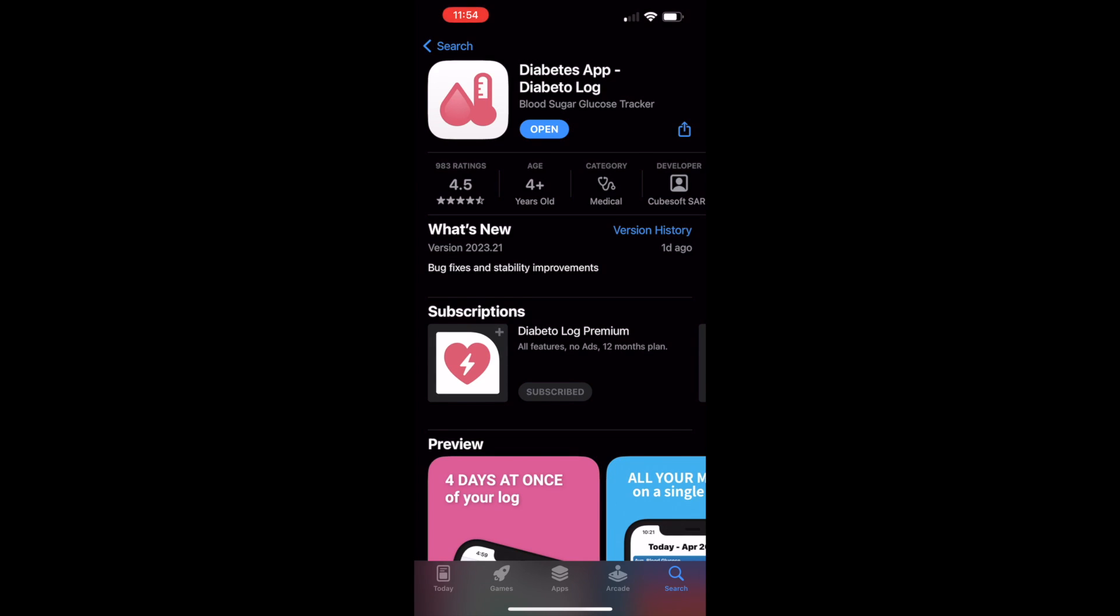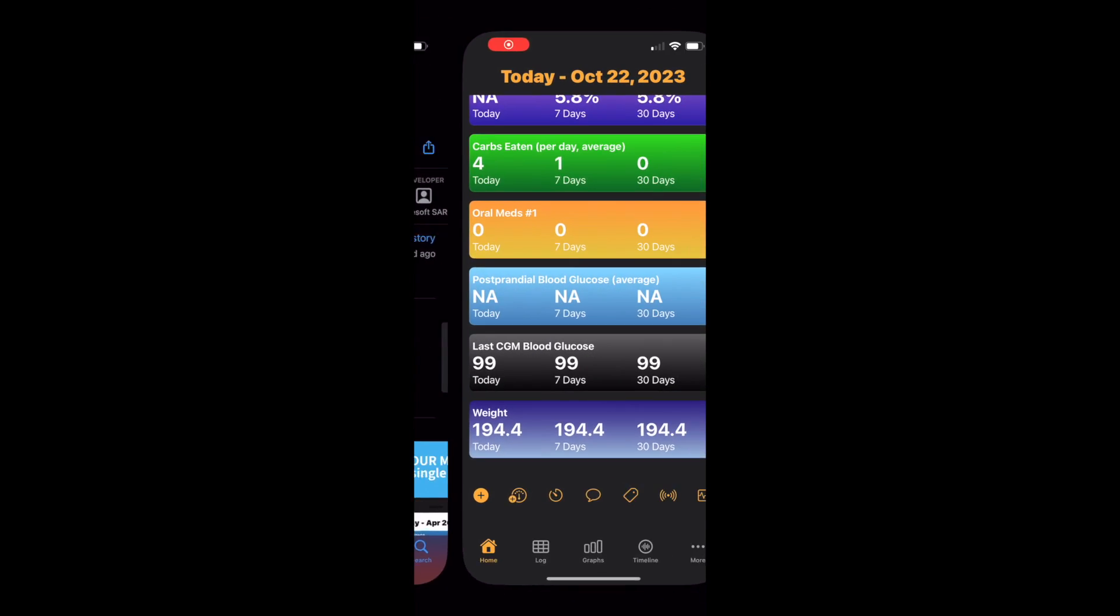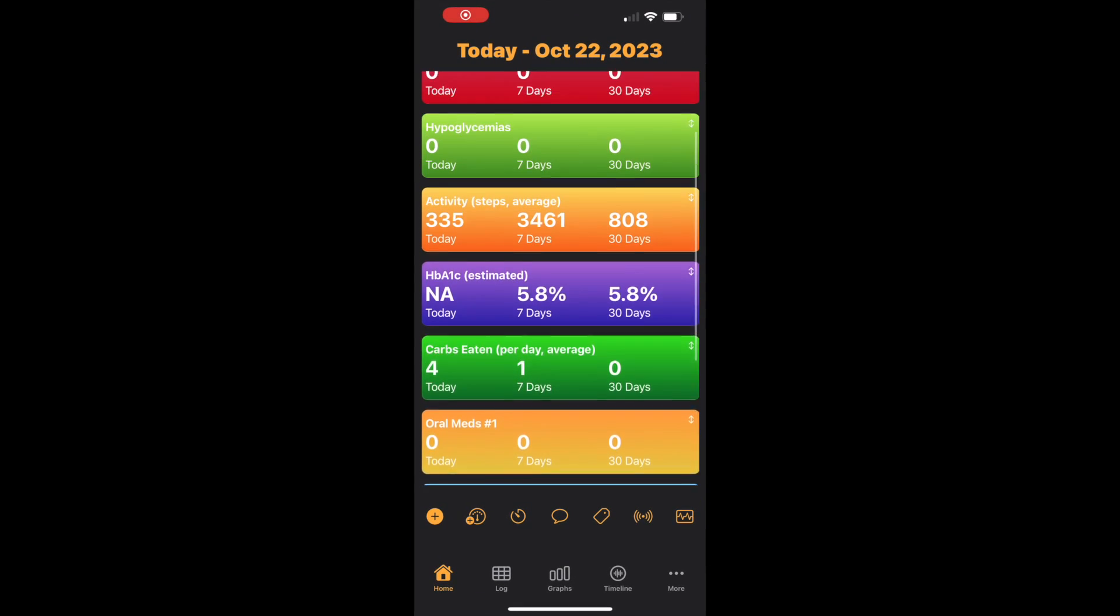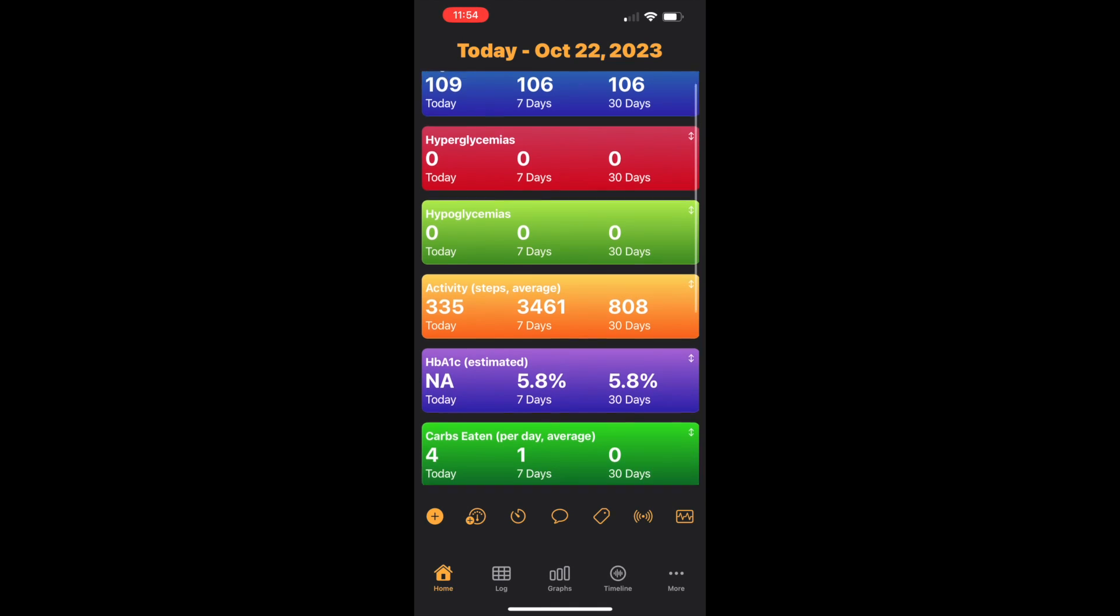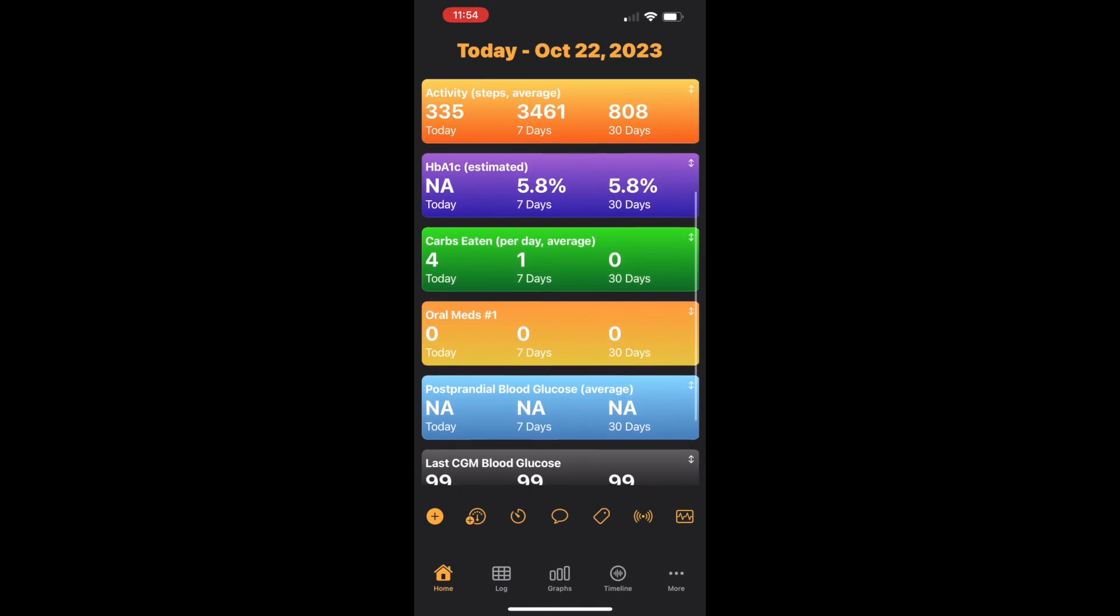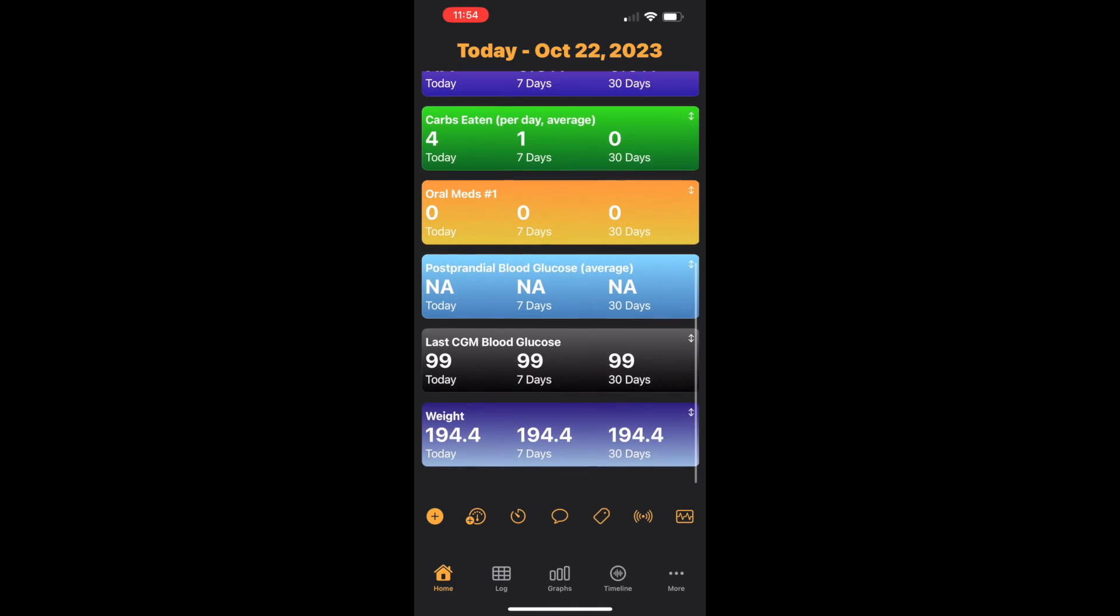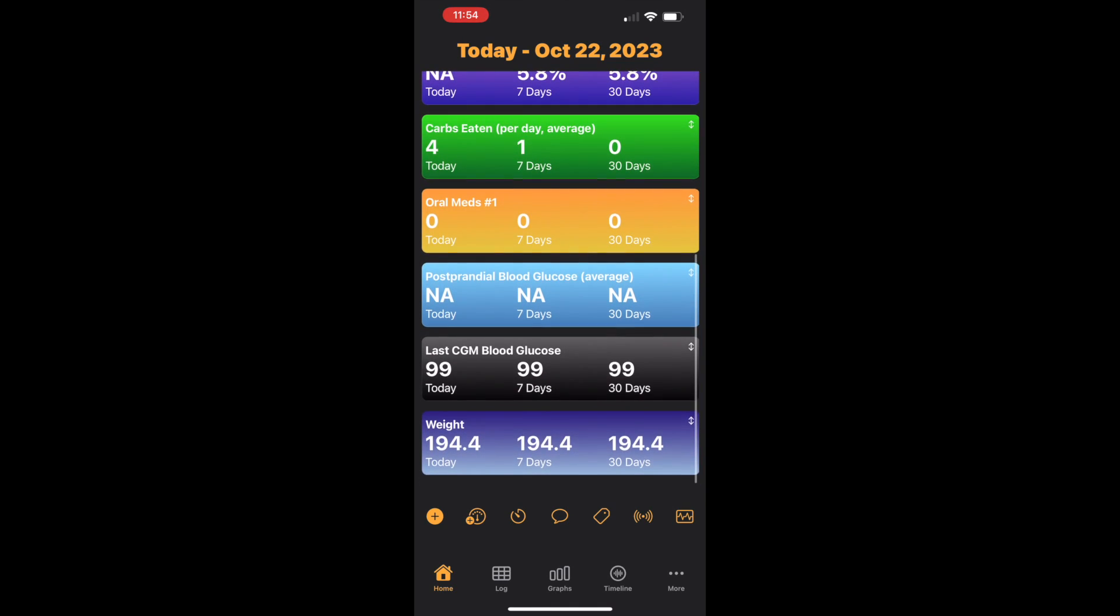So I've installed Diabeto and Libre Linkup. This here is Diabeto, and you'll see my last CGM reading.